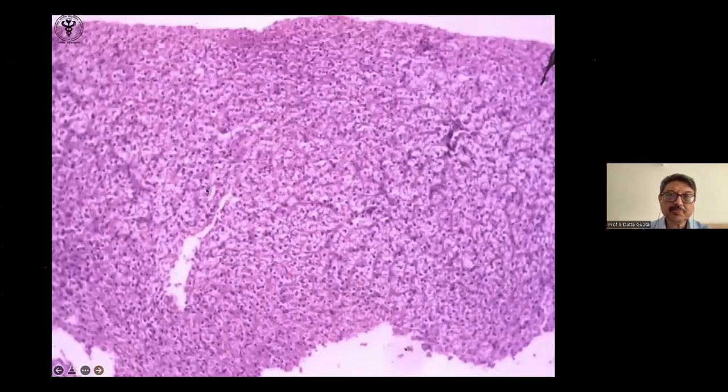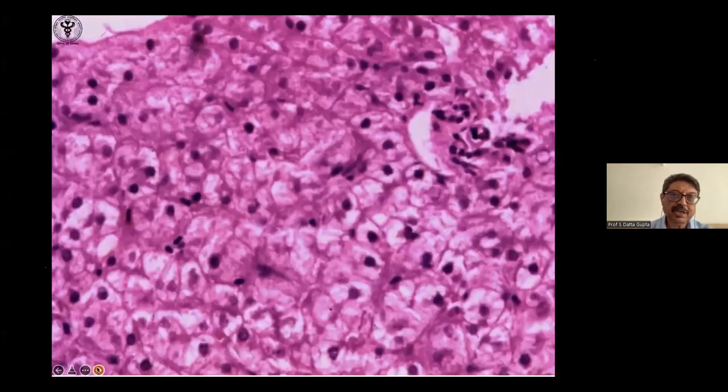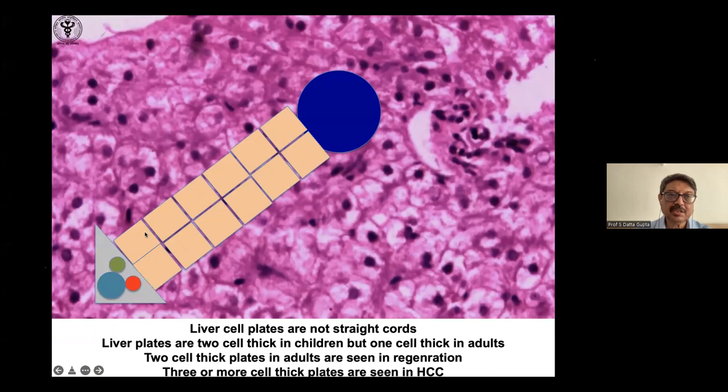So this is the liver parenchyma, and please note it is nowhere near what is shown in textbooks or what you write, like it's very nicely arranged in the form of parallel cords of cells with the canaliculi here and the sinusoid here. The liver's cords are in the form of a maze. It has to slow down the blood. Only then the Kupffer cells can find out if the RBCs are damaged or not and engulf them, and the exchange in the space of Disse can occur properly.